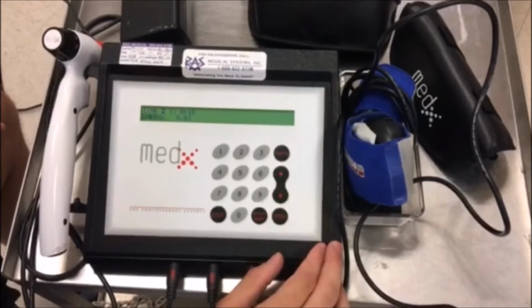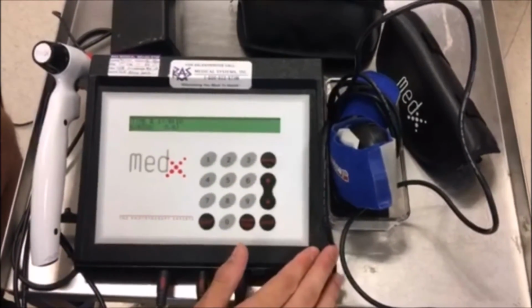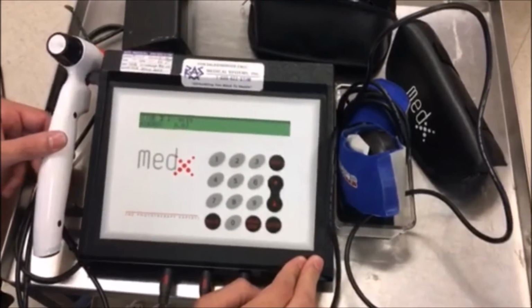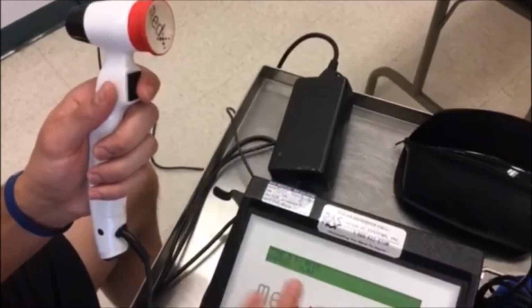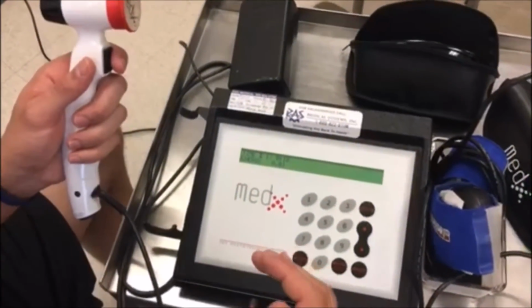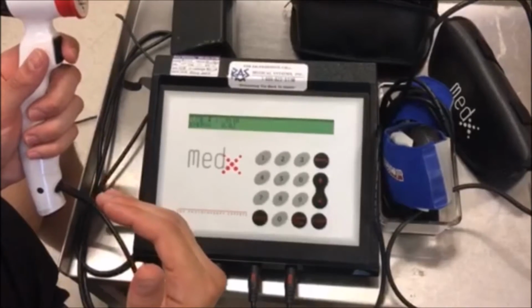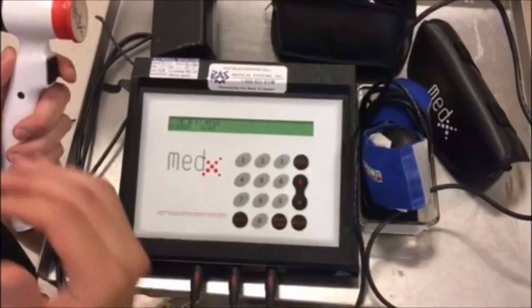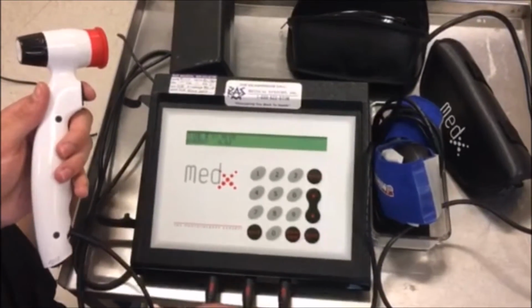Just to keep in mind, we can press start and the menu says the treatment will start in a certain amount of time. However, we can only start the treatment if we click this laser gun trigger over here. Going back, we selected port 1, which is only a laser treatment, but if we were to select port 2 or 3, we can still administer the laser treatment and the SLD treatment, or just the SLD treatment alone, as long as we choose to press the trigger or not. That will depend on what we're treating.